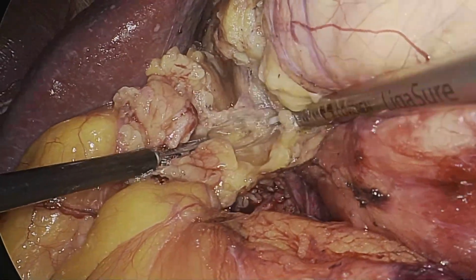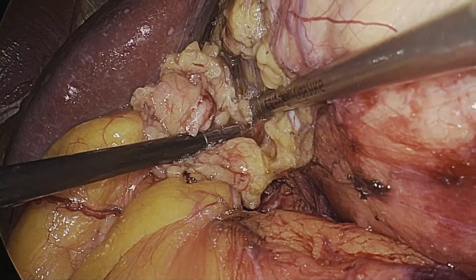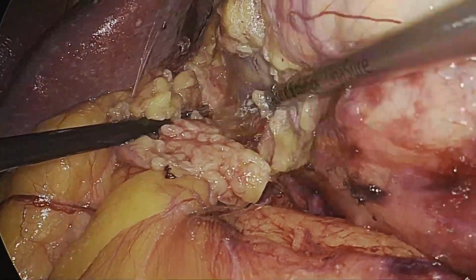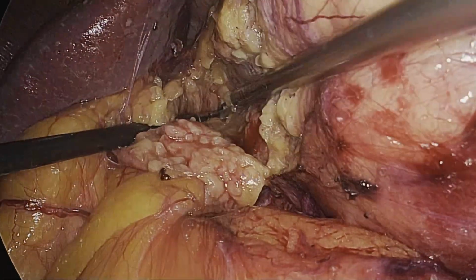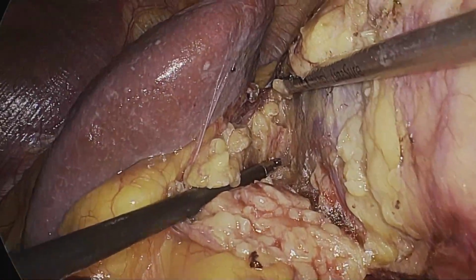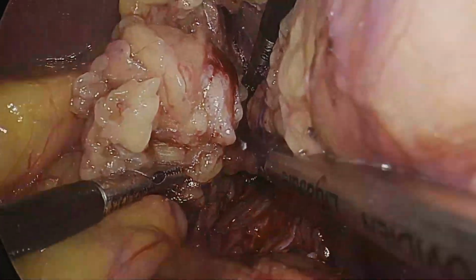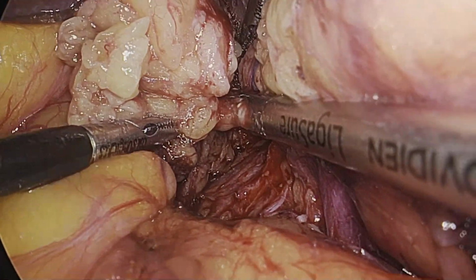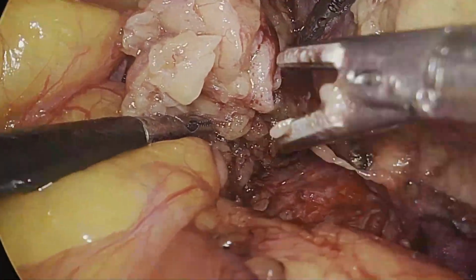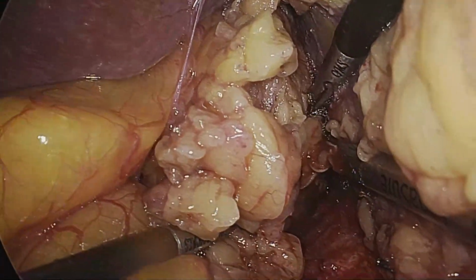There can be a few arteries coming from the renal artery towards the adrenal gland, as it has a three directional blood supply. So this dissection should be done very carefully. So here we have separated the adrenal gland completely, and then we'll move towards the hilum.